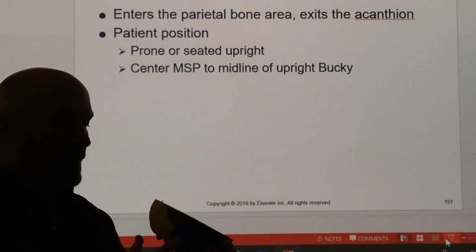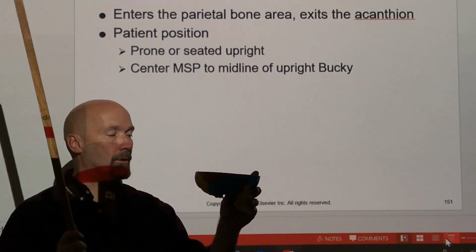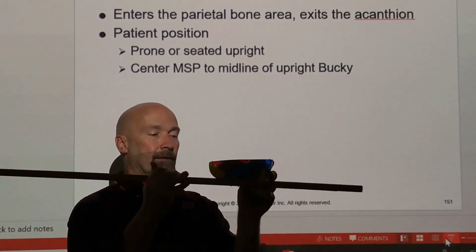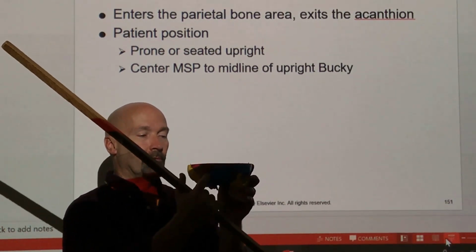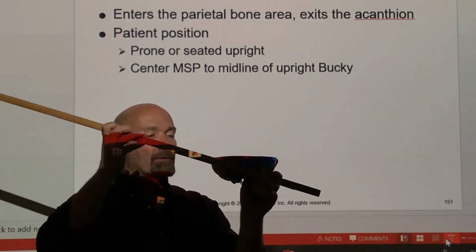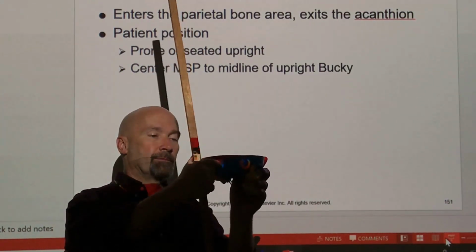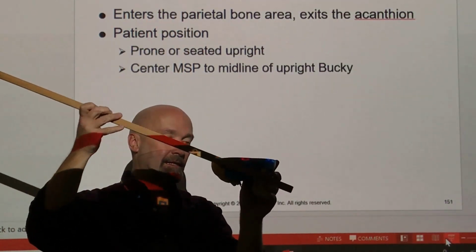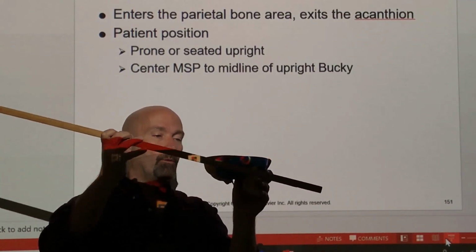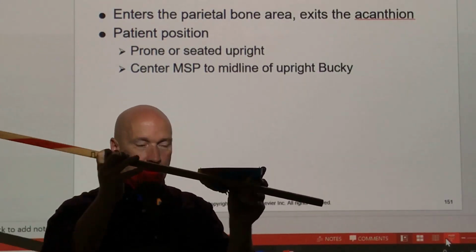If you remember, whenever we shot a Caldwell, what we have with the PA actually is a perpendicular central ray, and it put the petrous ridges, which were right there, right in the middle of the orbits. And if we angled our central ray caudally, the orbits didn't really move all that much, but the petrous ridges being back here were projected down into the lower third of the orbits. Okay, so what we had was an angulation of the central ray in relationship to the patient.